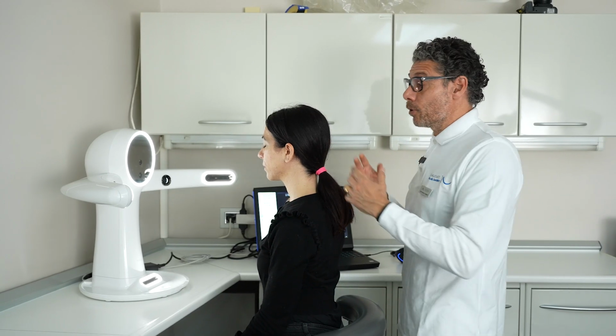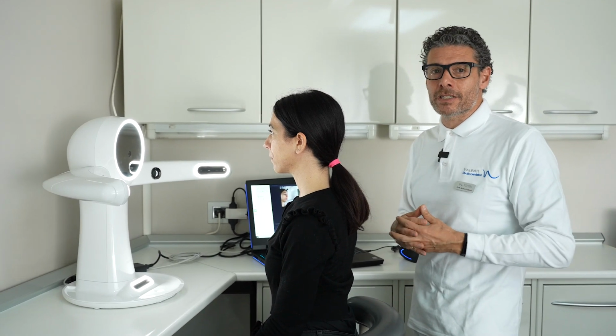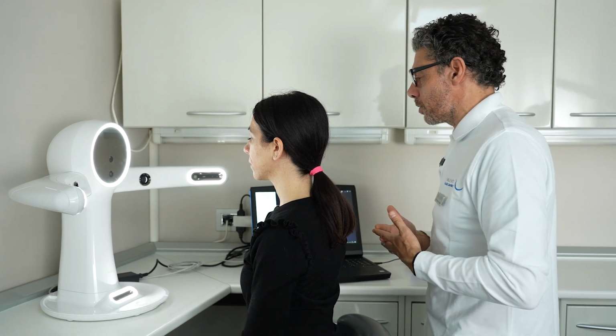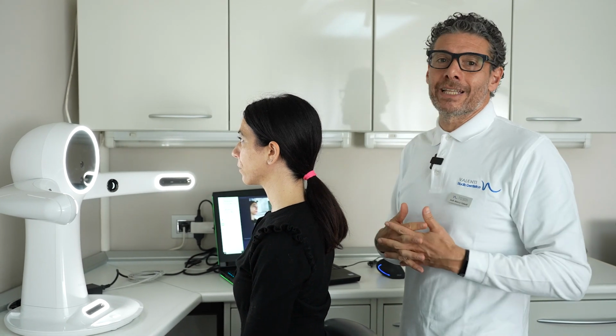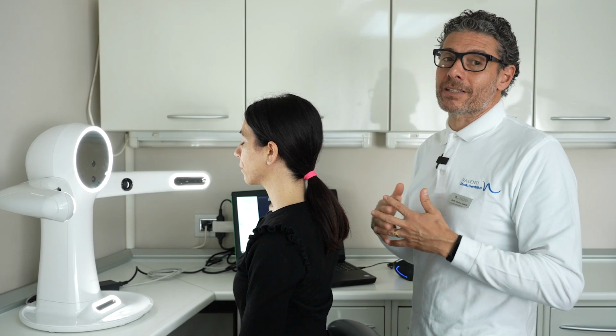If it is possible, the ears should be uncovered. So ask the patient to pick up the hair if she or he has long hair. The ears must be clearly visible within the scan, because we know that some aesthetic reference planes for aesthetic case management have a need to go through the auricular area.